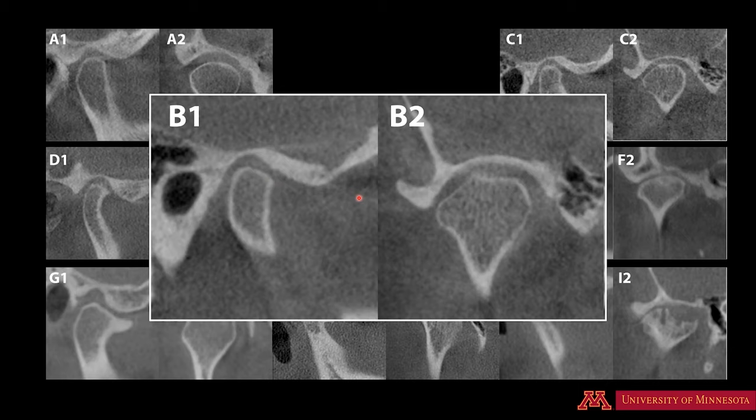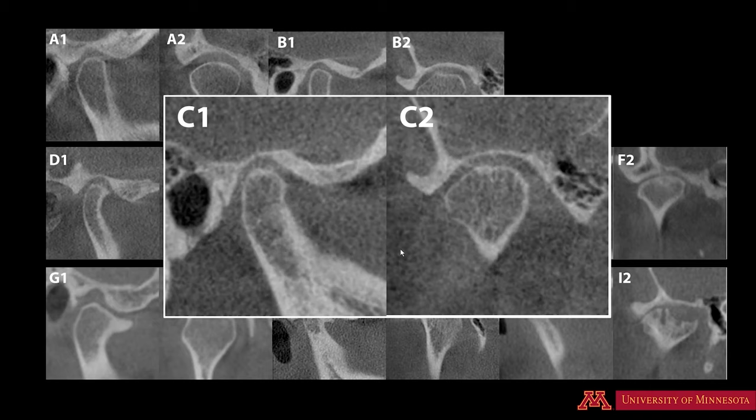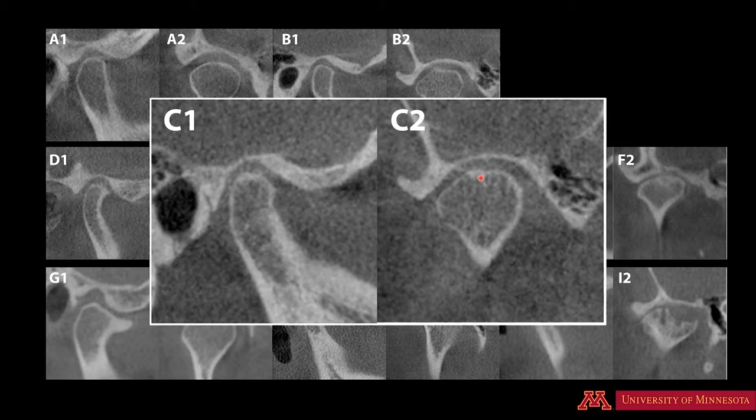On B1 and B2, we see flattening of the anterior slope or flattening of the lateral slope. There is no discontinuity, no osteophyte, no erosion, no subcortical pseudocyst, so we'll call this joint remodeling. On the next patient, we have localized subcortical sclerosis and some flattening — this is also an example of remodeling. Remember that for remodeling, we need one or both features of flattening and subcortical sclerosis.